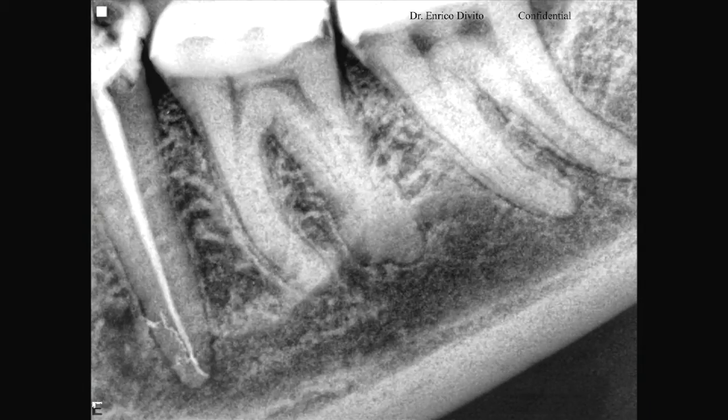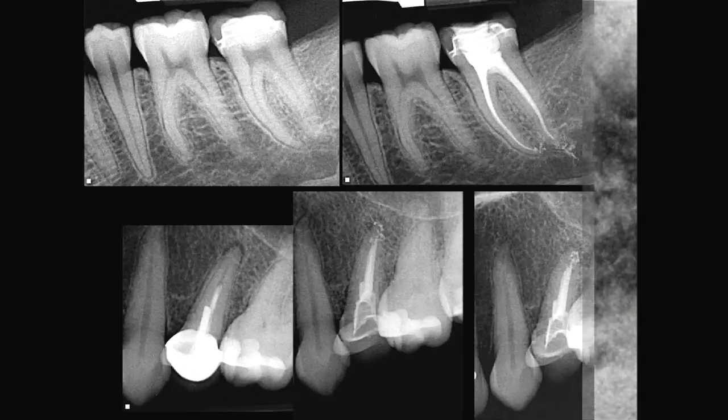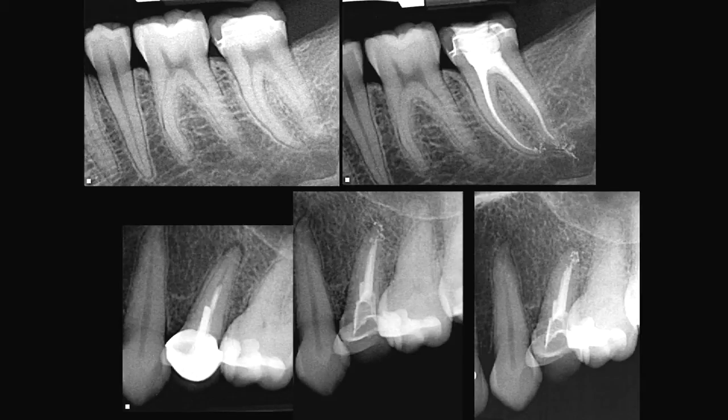Here's another great one — this is my lightning bolt special. Try to get a file to negotiate that curve.